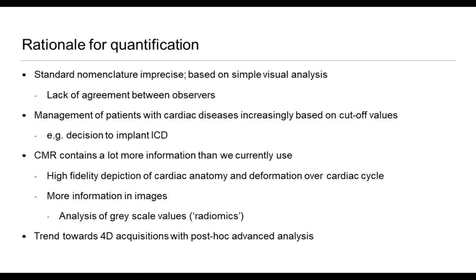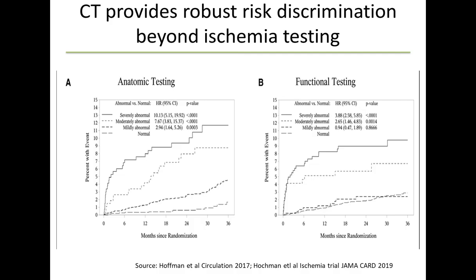let's see, the presentation now jumped. I have another presentation in front of me right now. Sorry. Let's get back to the slide that I wanted to show you. Okay. Standard nomenclature is imprecise, lack of agreement between observers.